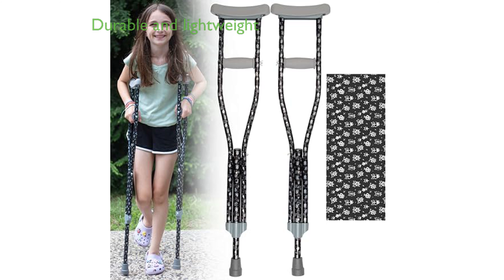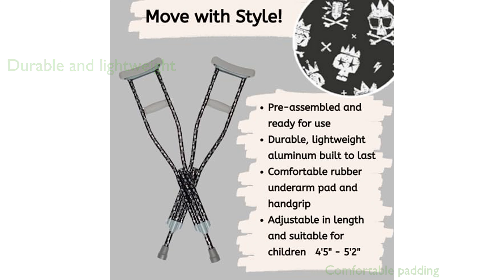Crafted from durable, lightweight aluminum, these crutches are built to last while being easy for a child to carry. The built-in underarm and hand grip padding provide comfort, making it easier for your child to move around.